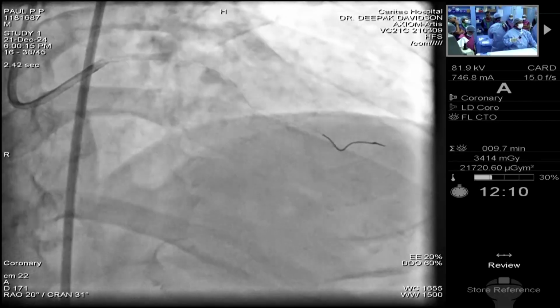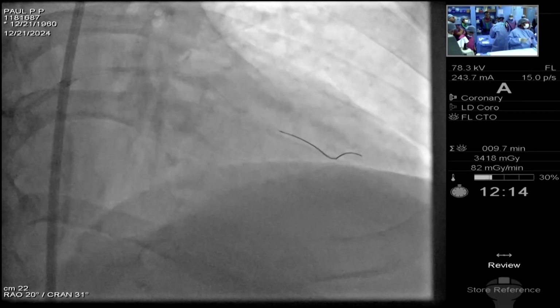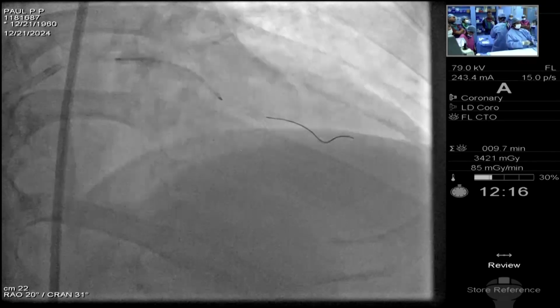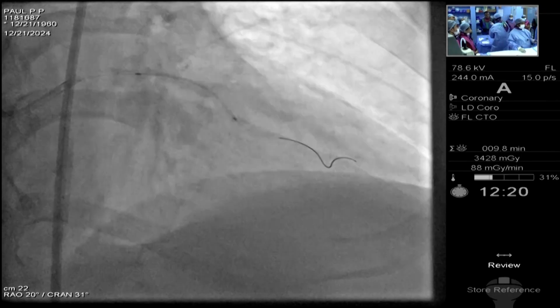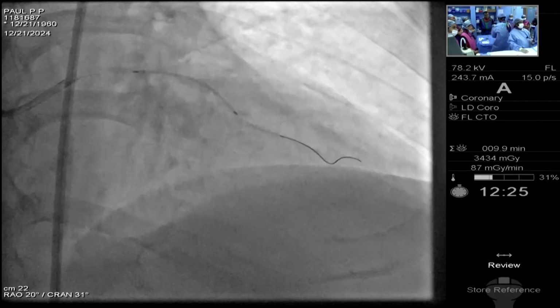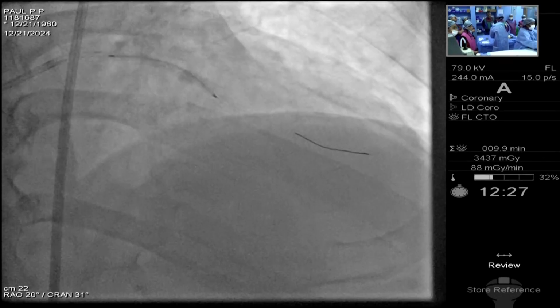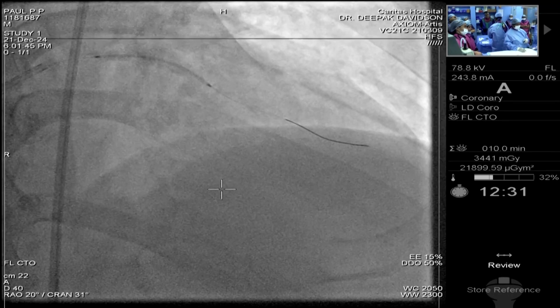But here it's almost 30 millimeters. You are not sure where exactly you should be dwelling. The burr should be dwelling, or should we keep moving it up and down like this? If you keep it moving up and down, the luminal gain will be very less. So when you see a diffuse lesion 30 millimeters or more than that, rota would certainly be better, I feel.